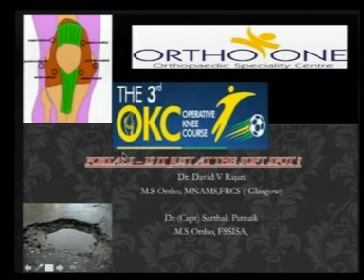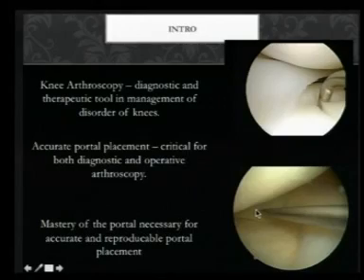I found that there is a lot of new knowledge in it and a lot of points which I could bring to this talk. If you see this left-hand corner picture, this is a picture of various portals that was given to us in earlier books as well as texts. You had only one anteromedial portal, but now making the anteromedial portal is an art in itself. We'll see that in a minute.